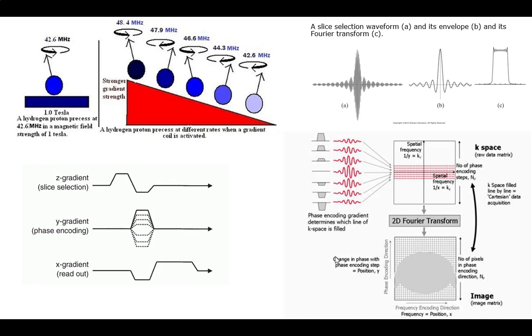And at this point, once the dephasing frequencies are set, they're going on. Now I'm going to do my echoing or whatever. There are gaps between these; they're just not drawing them. And then later on, when I'm getting ready to read out at the last second, I want this to correspond with my analog-to-digital converter, the ADC readout.